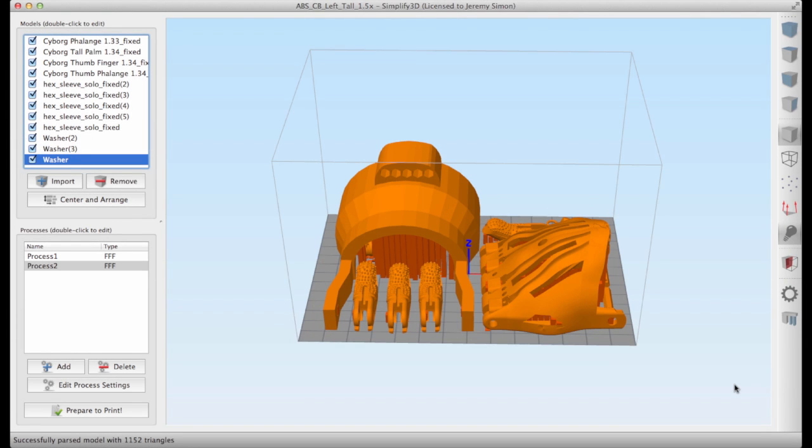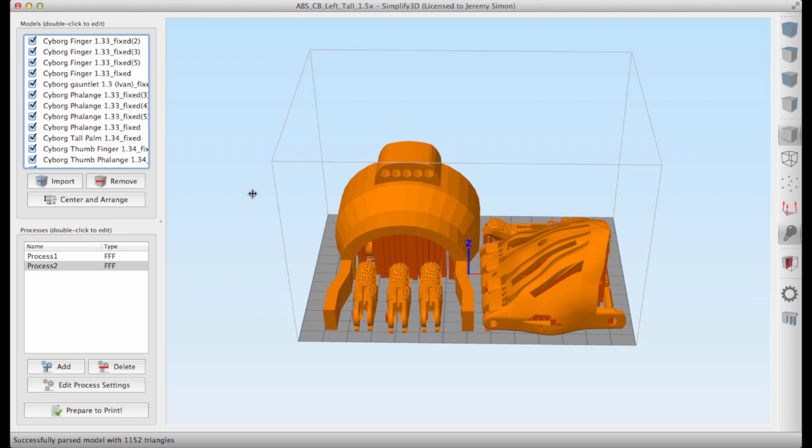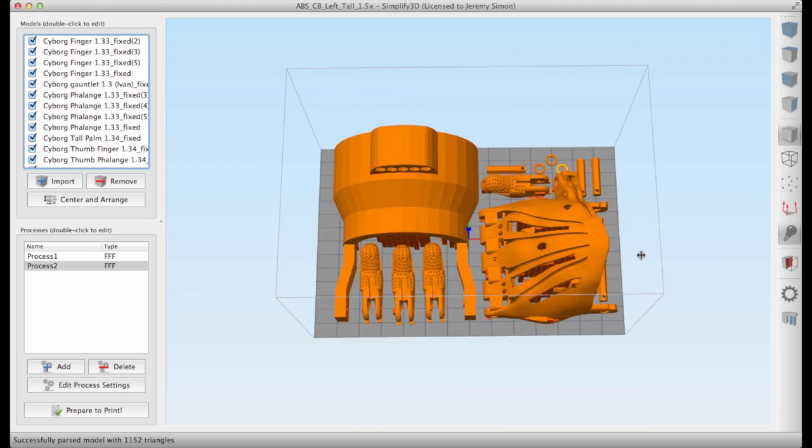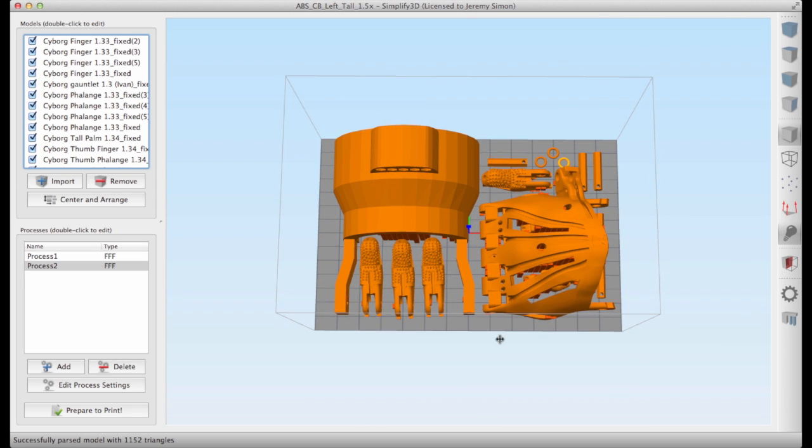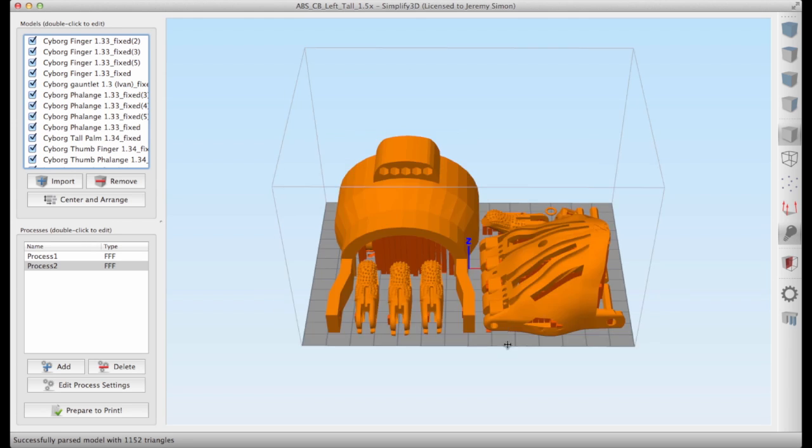So here we are in Simplify 3D, and this is the build plate that we set up for this experiment. As you can see, we have all of the various pieces. They are all laid out, but you can't see all the fingers, and that's because some of them are actually laid out underneath the palm and underneath the gauntlet.